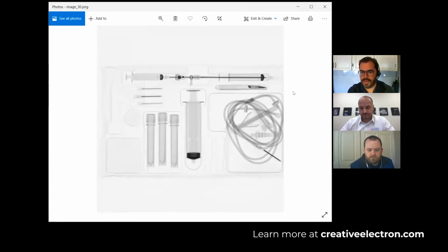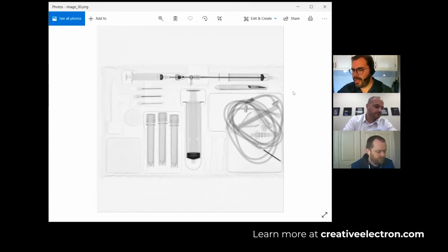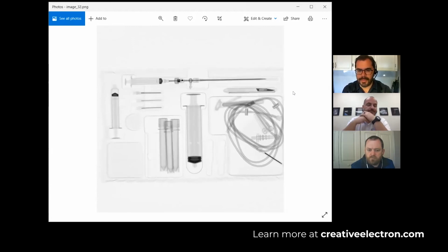And there's two levels of what we can do here, depending on what the client needs. Is location important? Do they have to be in the same location every single time? Is a doctor almost closing their eyes and just grabbing it? Or do we just need a complete kit? Are they going to be open and just put on a shelf? So this is where our vision tools come in. Do we create a search region for the component? I can see here, like this one, the three vials in the middle are on top of each other. Is that okay?